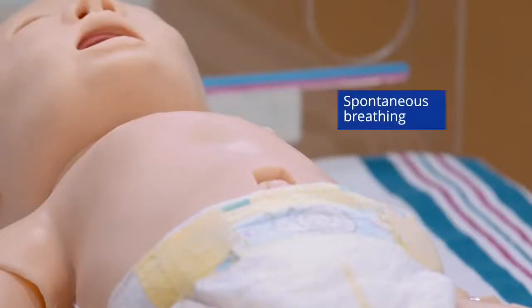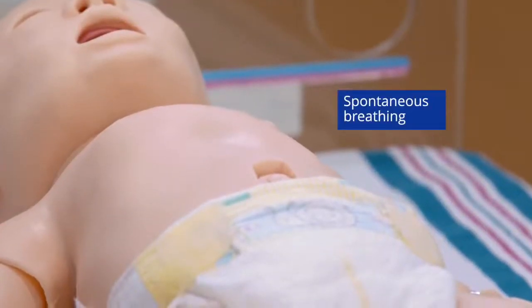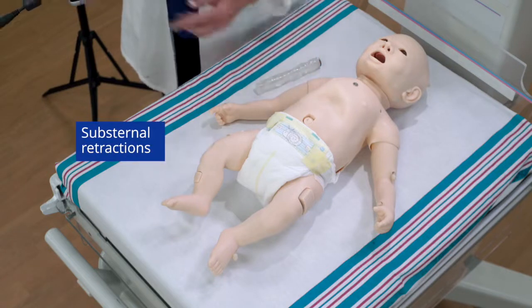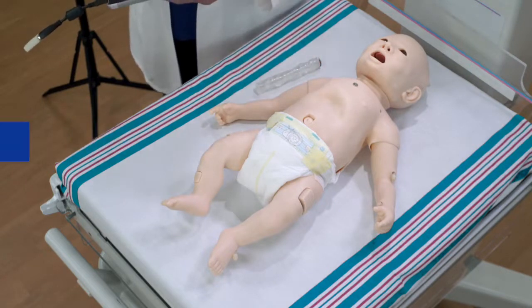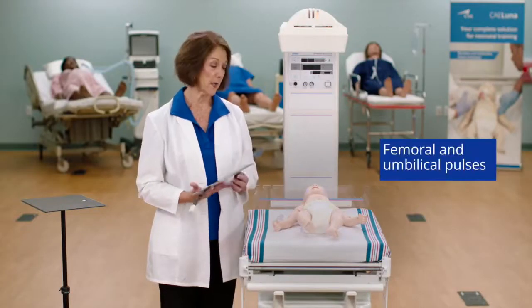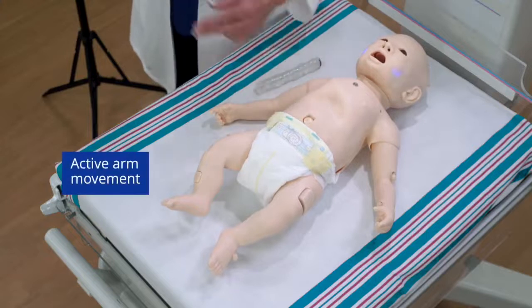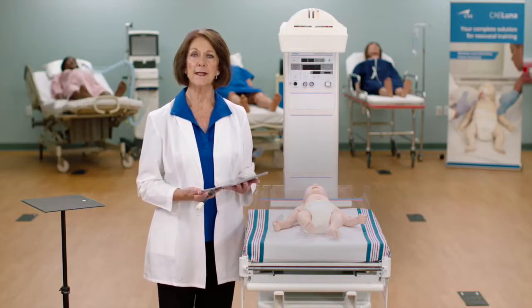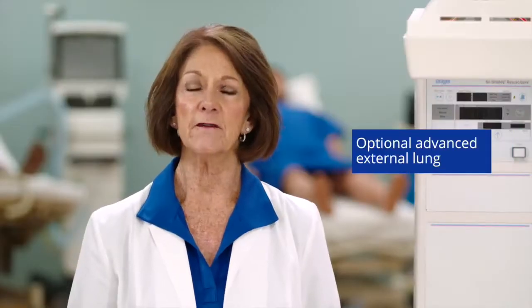Luna Advanced configuration adds additional features including spontaneous breathing, substernal retractions, laryngospasms, and cyanosis, femoral and umbilical pulses, and active arm movement. It also provides basic mechanical ventilation support with one level of lung compliance and resistance, plus an optional advanced external lung for more advanced mechanical ventilation support with varying degrees of compliance and resistances.